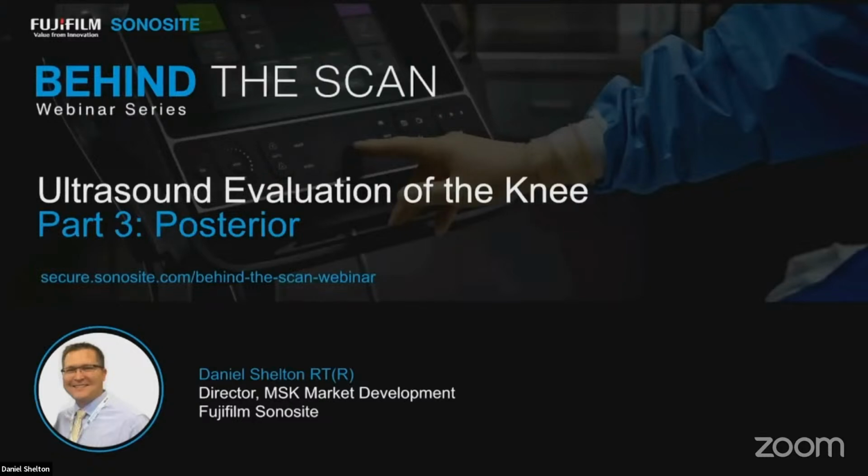And reminder, this is the last of the three-part series, so we can also do some recap during the last part of the Q&A for the live scanning. We'll jump right into it about the anatomy of a Baker's cyst in the posterior knee.